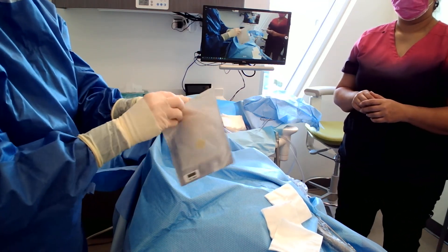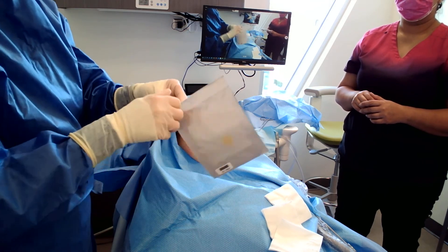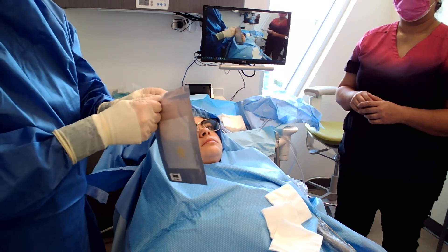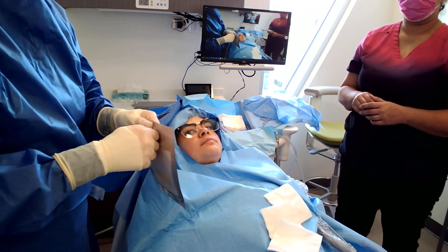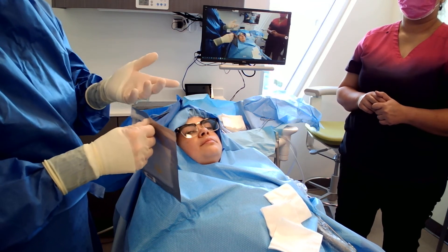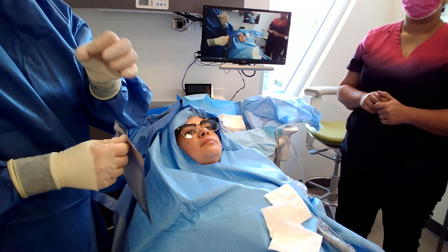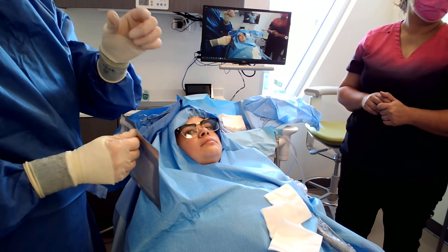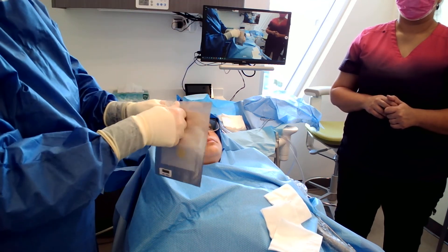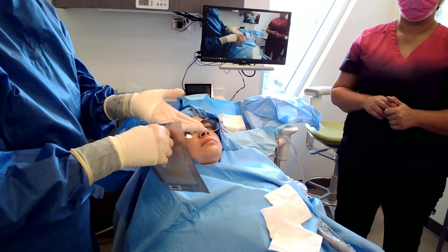Typically I would grab some pickups to take this out. This is one that you have to rehydrate or reconstitute — that's another reason why it's really important to have a little bowl of saline. There are quite a lot of grafting materials that come in granules that you'll have to reconstitute about 10 minutes before, just with a little saline. If you put too much water in, no big deal — just stick a 2x2 in there and it'll soak it up. Stroman is probably the most common, but you really have to read all the manufacturer's directions.